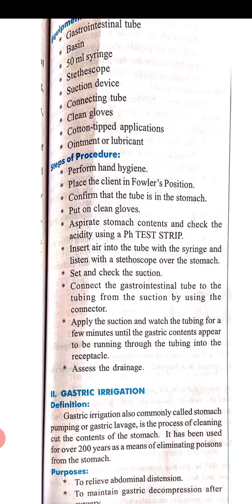Then confirm the tube is in the stomach, because after inserting the tube through the nose or mouth to the stomach, we confirm that the tube is in the stomach. How do you know that the tube is in the stomach? Before that, you should put on clean gloves.